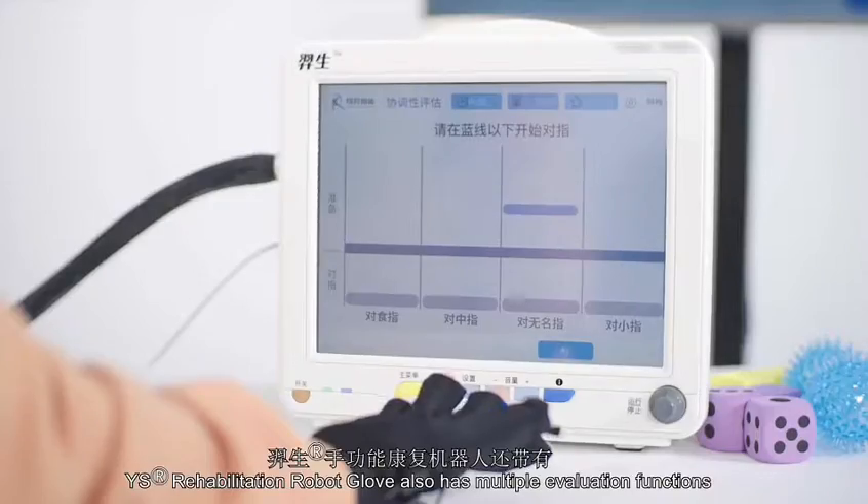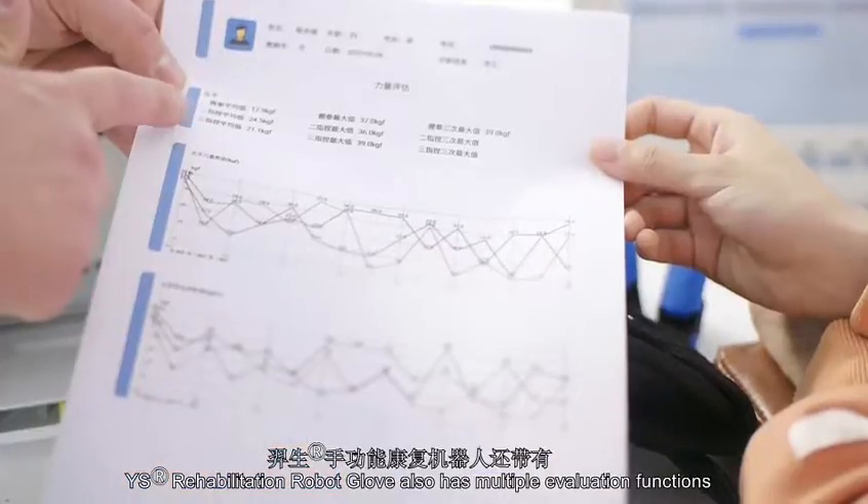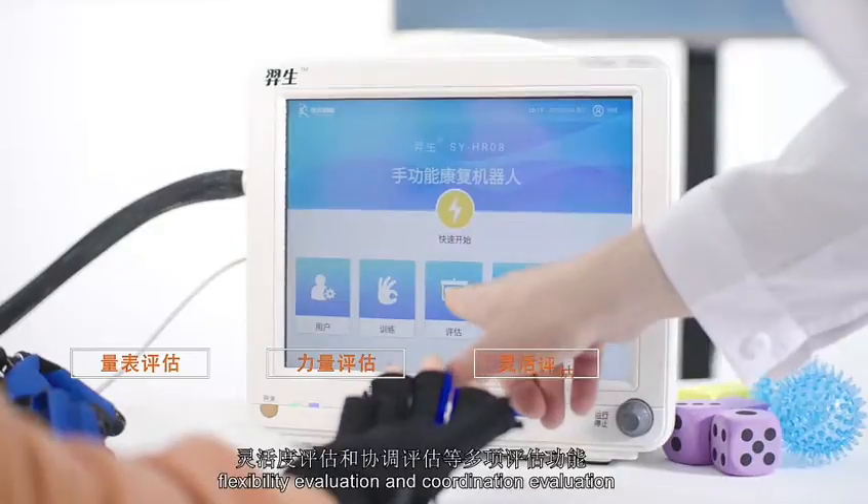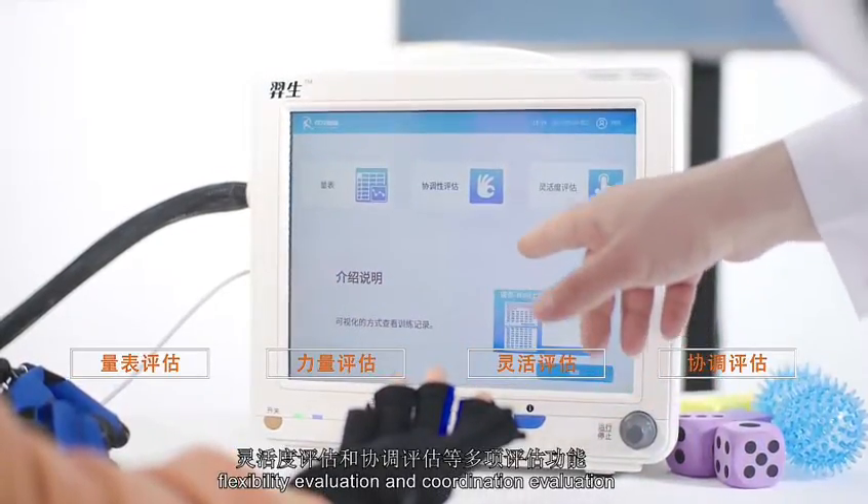YS Rehabilitation Robot Glove also has multiple evaluation functions such as skill evaluation, strength evaluation, flexibility evaluation and coordination evaluation.